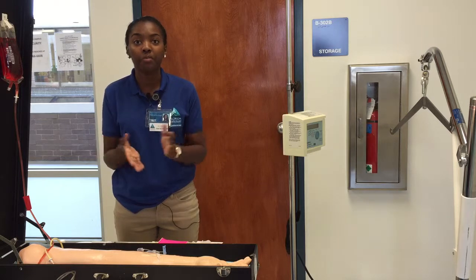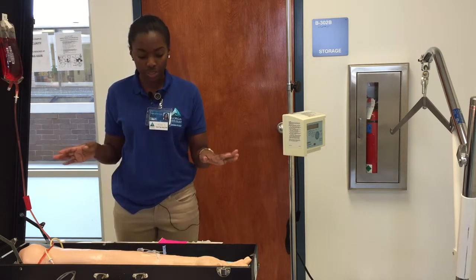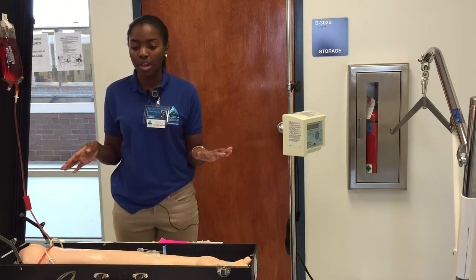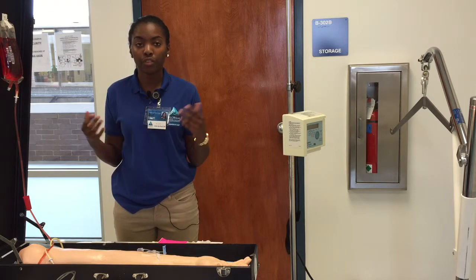Administering your medication via minibag. There's an INT in place, and there's nothing infusing. It shows the primary. So I am going to assess the doctor's orders, make sure it's for the correct patient, the medication, the dose, the amount, and the frequency.